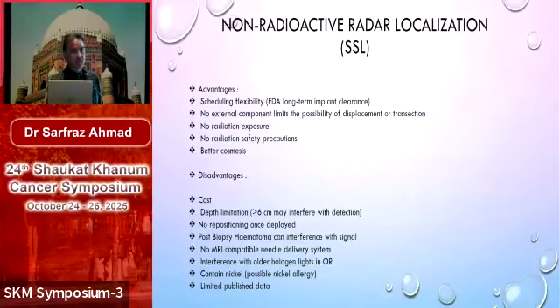Now we use this in our hospital and we have deployed many in many patients. The overall results are good, but this is one of the absolute contraindications. We came across a few patients who had nickel allergy, so we had to postpone their device deployment and utilize other devices. Apart from that, we had a good experience with the Saviscout localization.